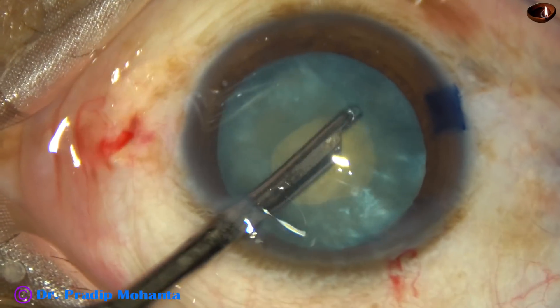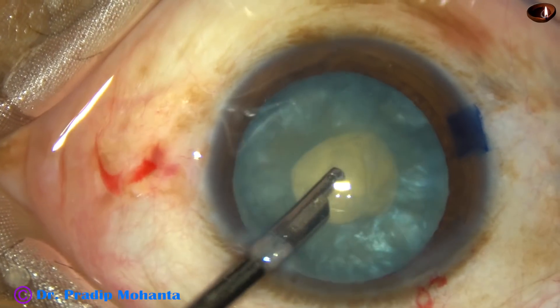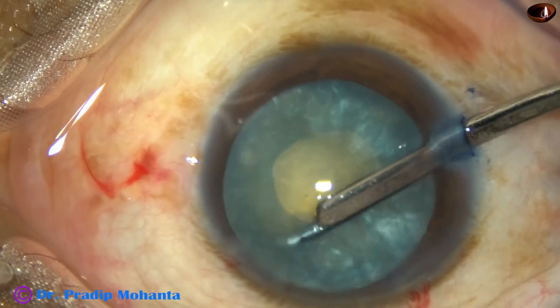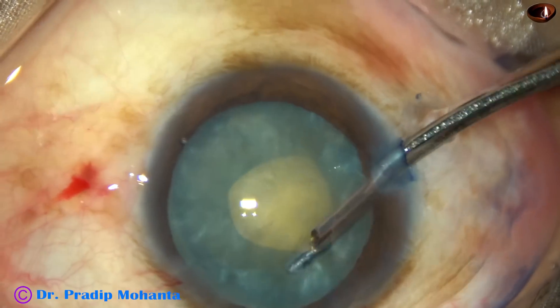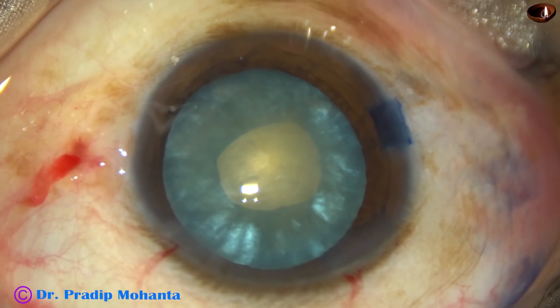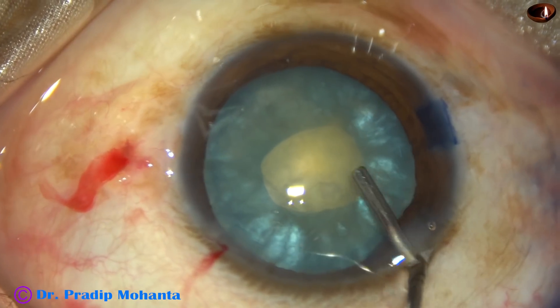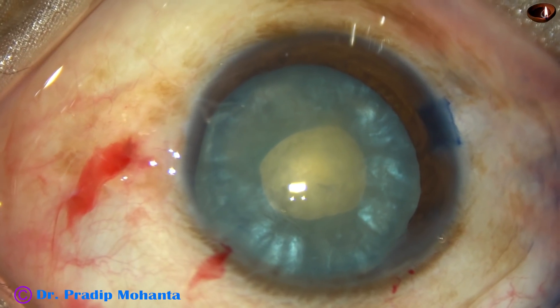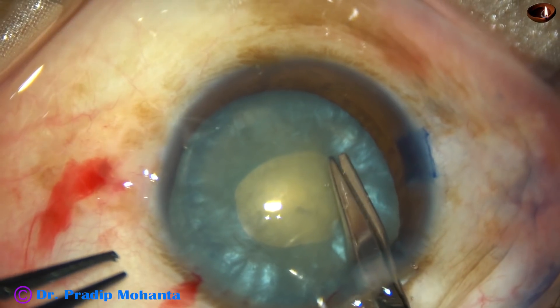Yes, if we reduce the intralenticular pressure by this means, the rest of the surgery will be very, very easy, just like any other cataract. 70-80% of these intumescent cataracts have a soft nucleus. The rest have a hard nucleus. So, 70-80% of cases are easy.